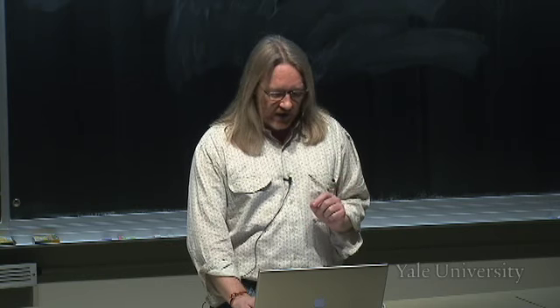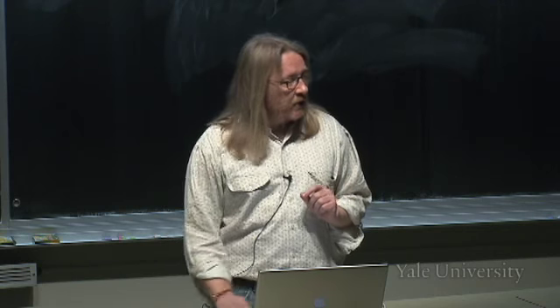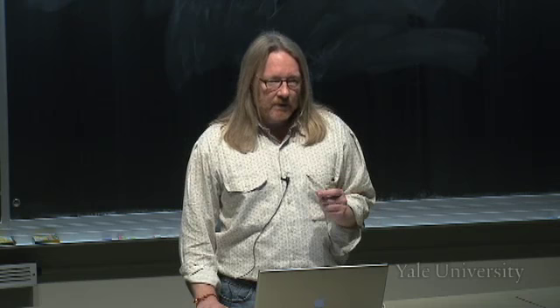Now, when I was introducing the subject, I didn't call it nuclear magnetic resonance imaging. I called it magnetic resonance imaging, or MRI, and that's the common name used for making medical images using this particular physical approach. And why do you think the name was changed from nuclear magnetic resonance to MRI during the 1980s when this technique started to be used in people?